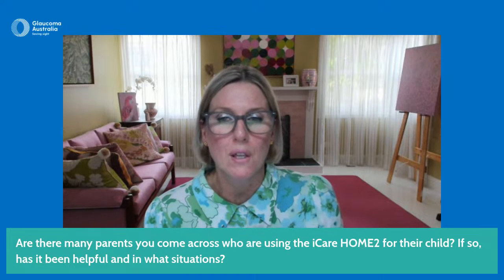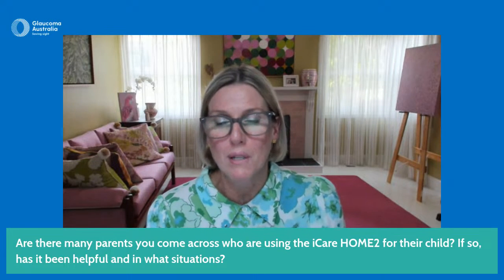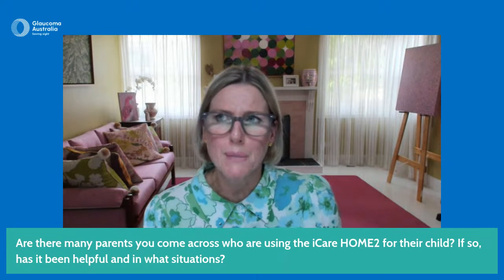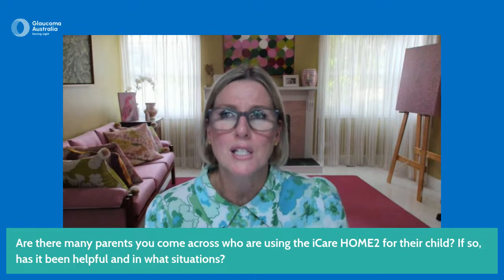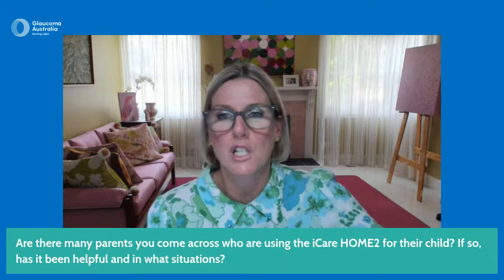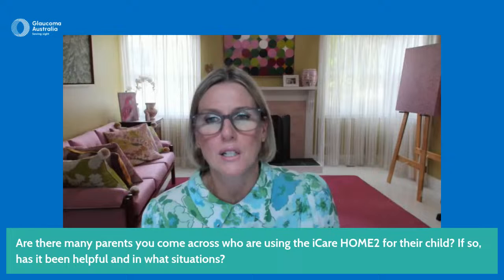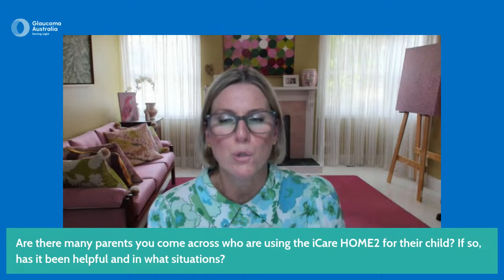So it's not something that we come across very often at all, but for those families in certain situations, it can be quite helpful. And maybe there's an opportunity to rent one if the doctor would like you to test the pressure quite often, but it's not very often that it's needed. So it's more for those special situations.